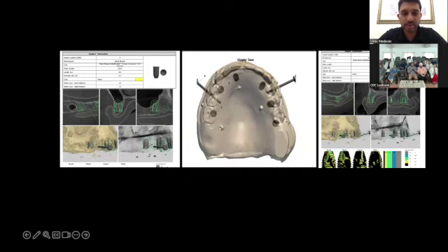So now if you look at this, basically this is the denture setup, correct? And you put these markers, and then you know that this is where you want your teeth to be. So when you're actually planning implants, you don't want them to go more facial. You want them to be in the right position, kind of equidistant from each other, and making sure that they come out from the occlusal aspect as much as possible. In some cases, you have to also consider multi-units. In those cases, again, you need to check the depth of their implants.